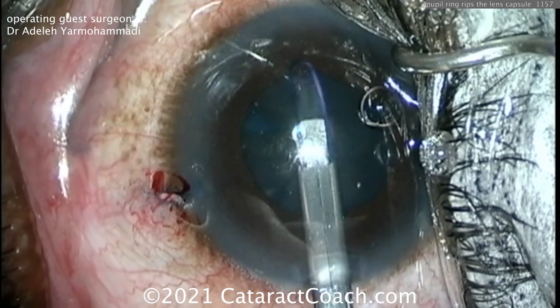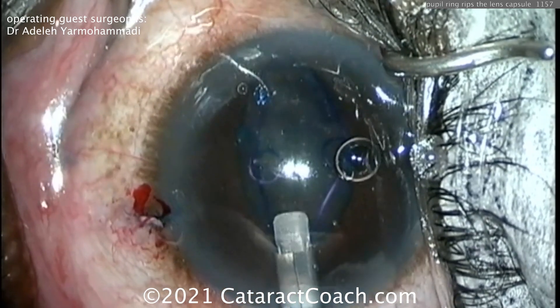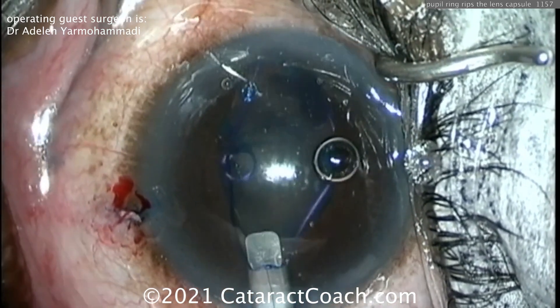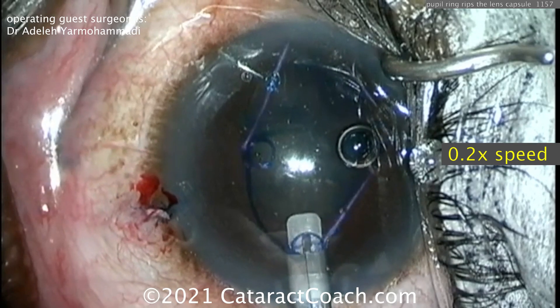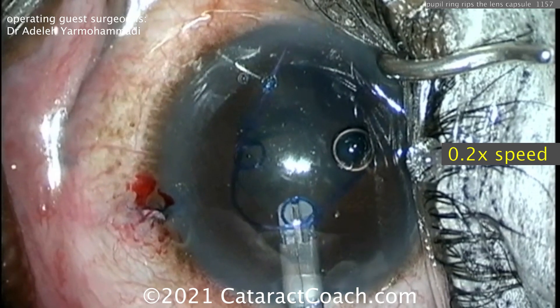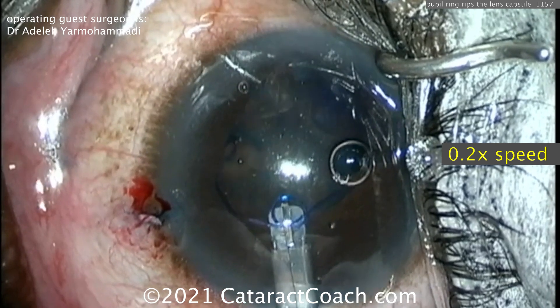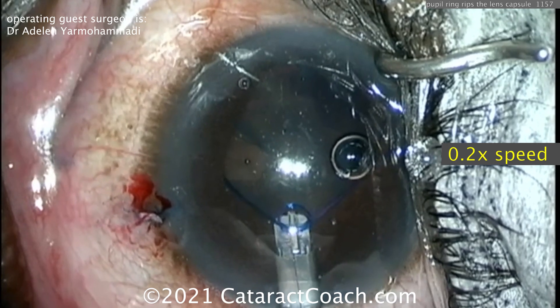The leading scroll goes into position — that looks great. The next scroll to the left slowly goes out, and right there, boom, it snaps out, hits the lens capsule and rips it. In slow motion you can see it's aimed a little too much towards the capsule, and it rips the anterior lens capsule. Now what do you do?